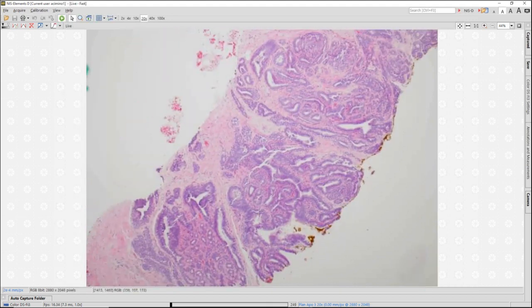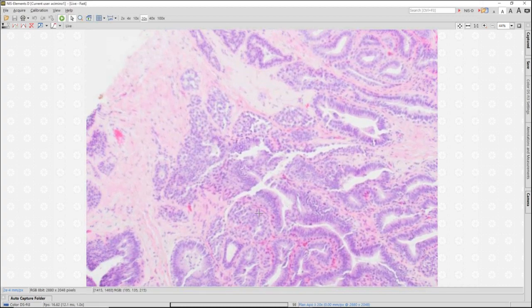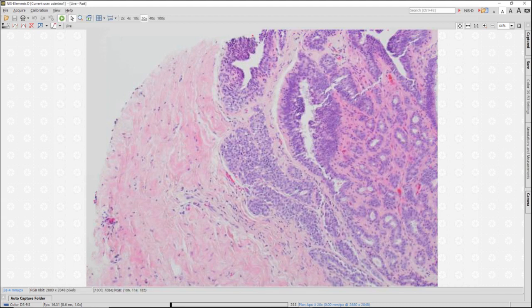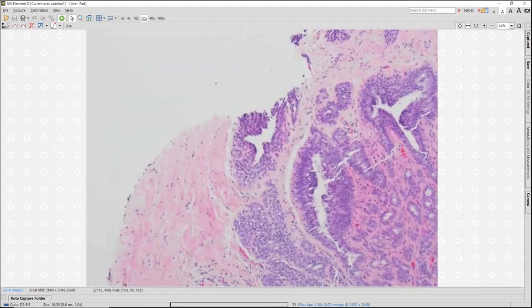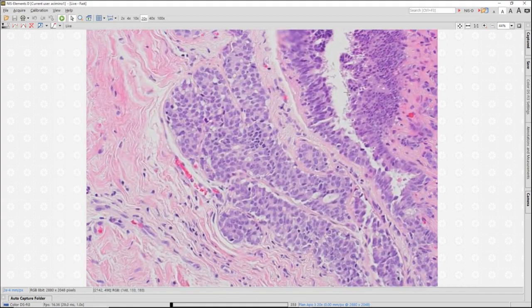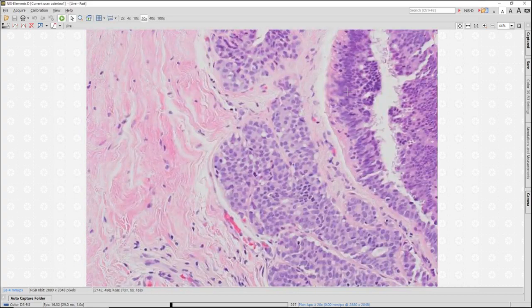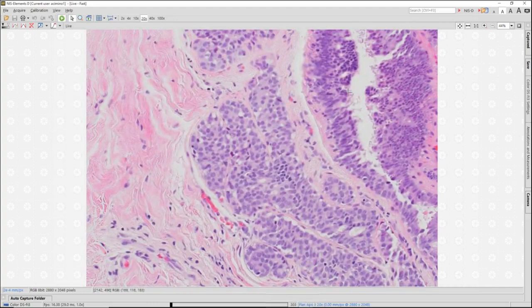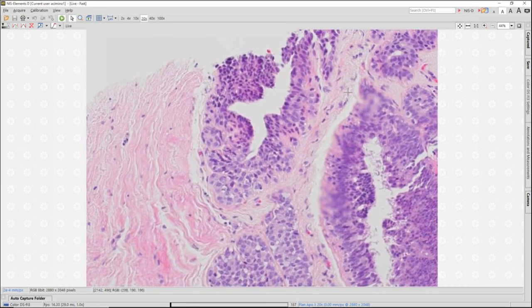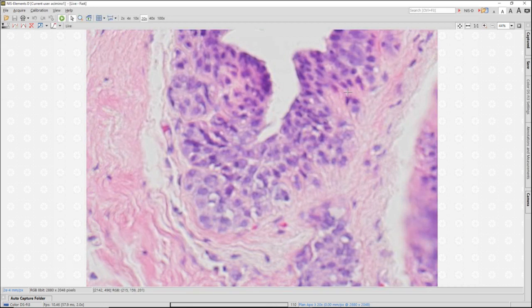But in this case, I also see an expanded layer outside the luminal cell layer, where I have to ask myself, what are these cells? Are they the myoepithelial cells, or are they lobular neoplasia, ALH, LCIS? In contrast to the cells in an adenomyoepithelioma, where the myoepithelial cells may show expanded, clear, bubbly, or vacuolated cytoplasm, ALH or lobular neoplasia cells tend to show one distinct, nice cytoplasmic vacuole.